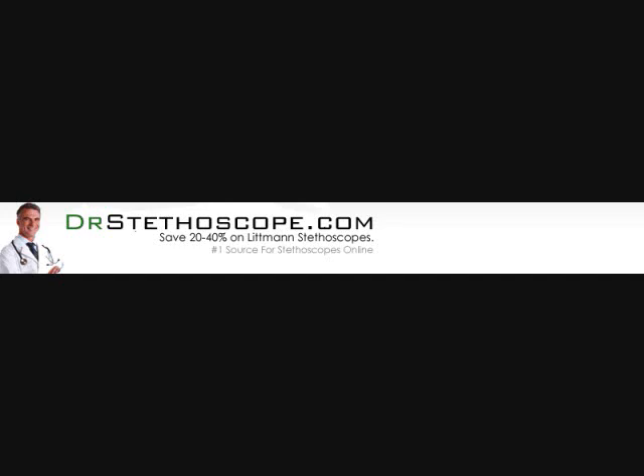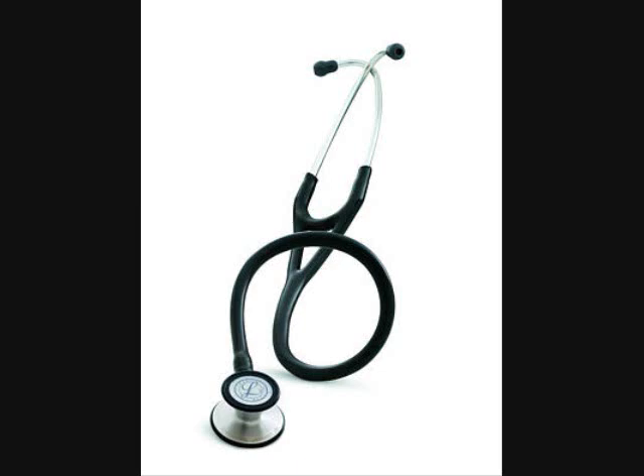Welcome to DrStetoscope.com. You're looking at the 3M Littmann Cardiology III Stethoscope, which has outstanding acoustic performance and exceptional versatility.